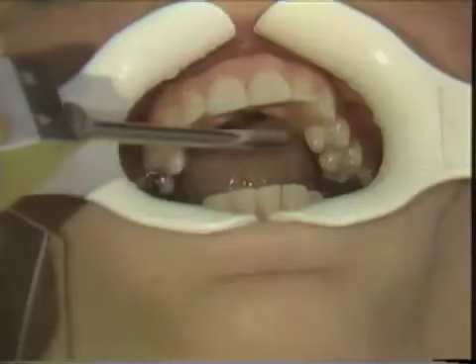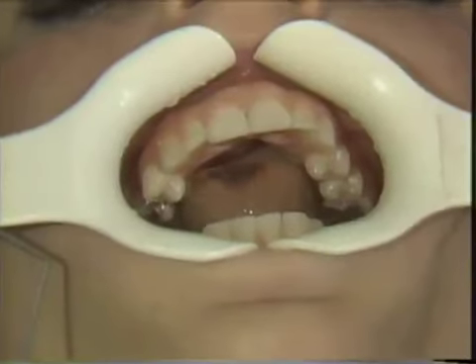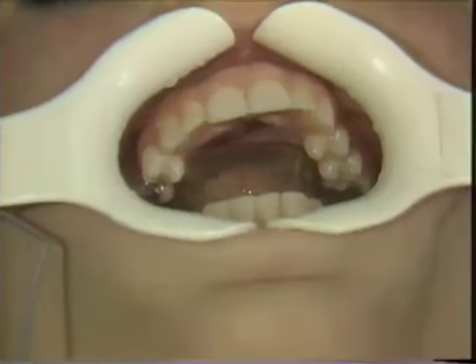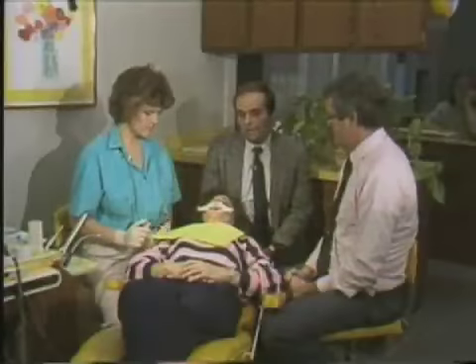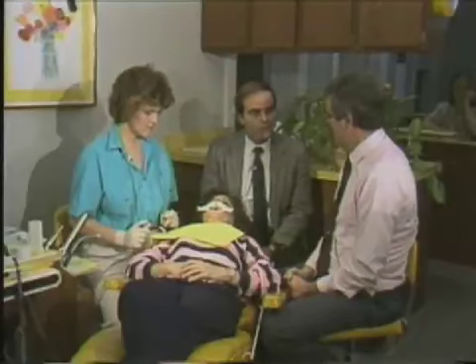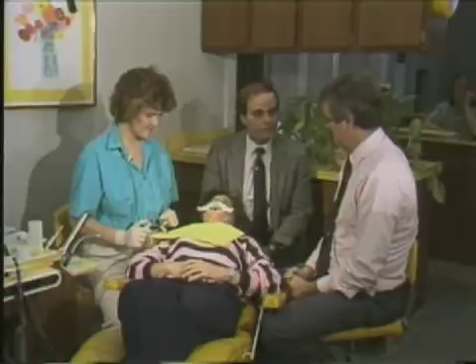All right, Liz has just finished the rinse process. And Paul, you want to discuss that as far as the importance of that and what the criteria are for proper irrigation? After the acid has remained on the enamel for 60 seconds, and not to exceed 90 seconds, because if it goes past 90 seconds on permanent teeth, it has the effect of wearing down the enamel tags.